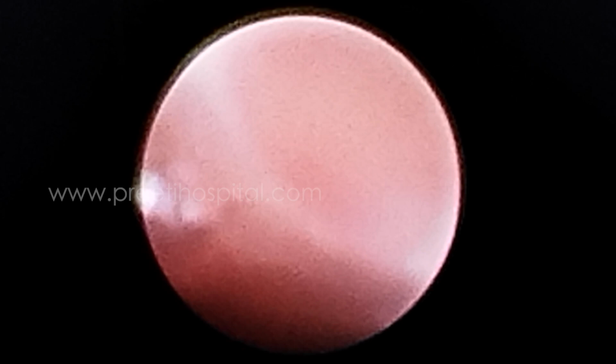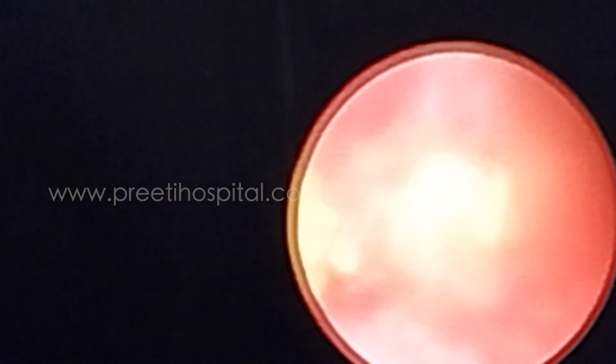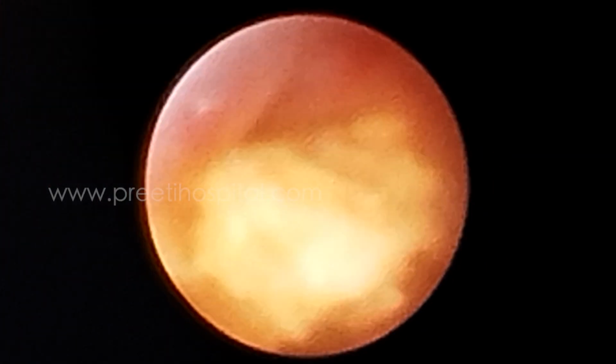Water is not there in this. Okay, that's why it is not coming. Water flow is compulsory, essential. The amount of the fluid taken in supine PCNL will be... See how the stone missed here. It is a calyx. So these are the things you should keep in mind, that as much as possible.